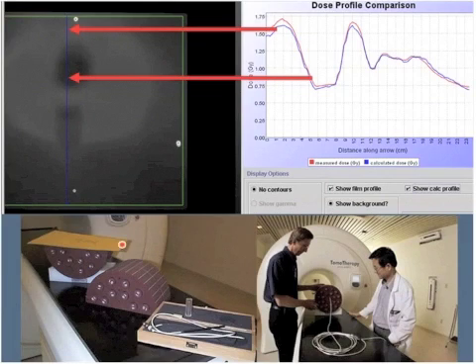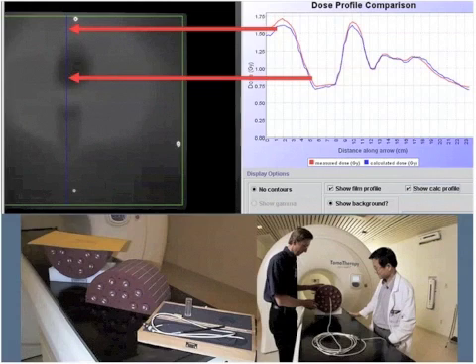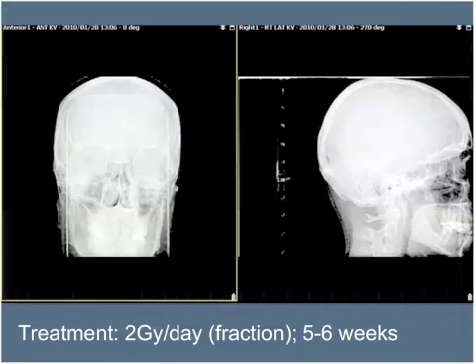So in our institution, we use phantoms. This is a cylindrical phantom that you can put radiographic film in and then irradiate this inanimate object with the beam pattern that you want to treat the patient with. And then you can see that you have reproduced a plan here in the film, and this plan was designed to spare the spinal cord and spare some central structures. This is a head and neck case, so it's sparing the trachea. And then you can compare what the radiographic film recorded versus what you plan to give and see that there's good correspondence between the plan and what you delivered in terms of these peaks and valleys. So this sort of quality assurance is important to have in place, and for intensity modulated radiotherapy, basically every patient should have an in-phantom quality assurance session or measurement before treatment commences.